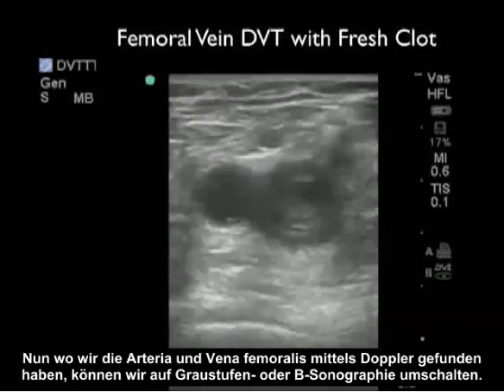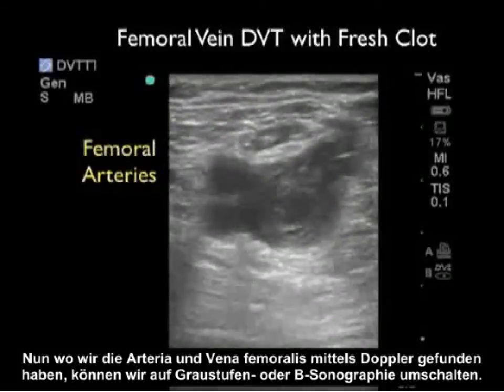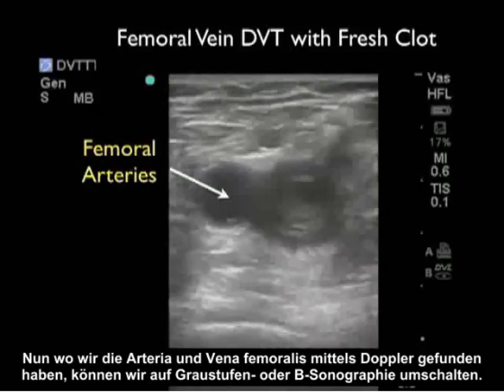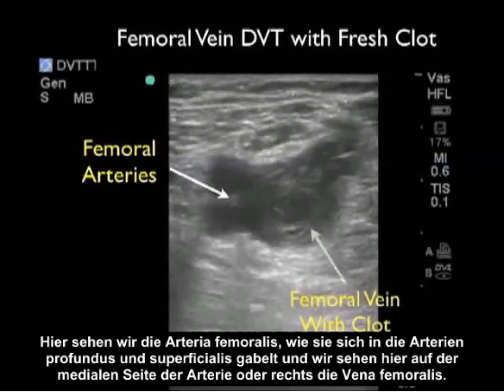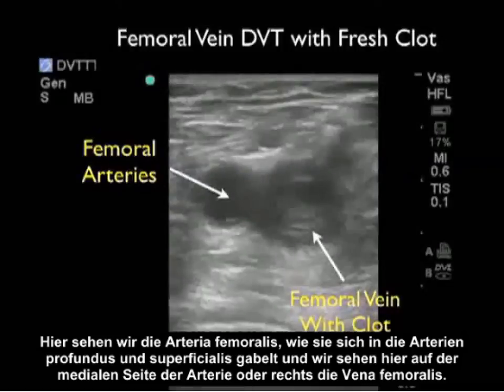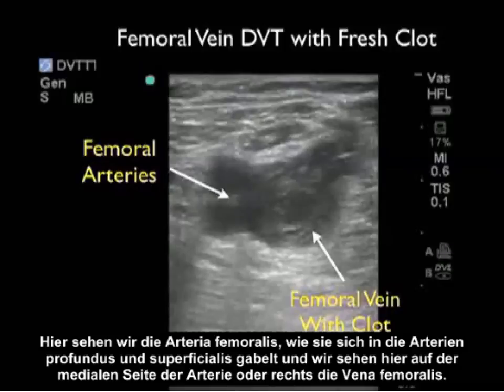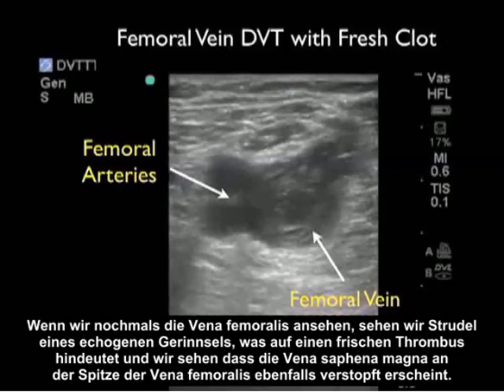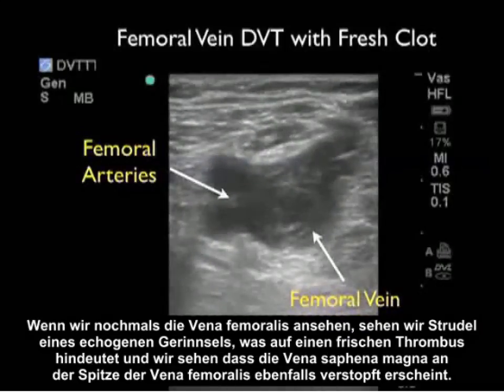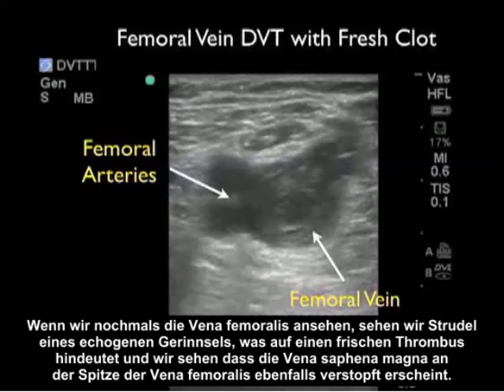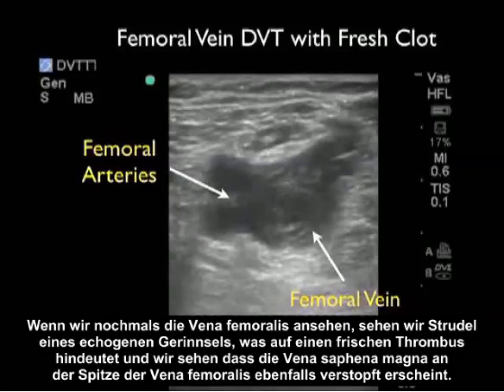Now that we've identified the target femoral artery and vein using Doppler flow, we can switch over to grayscale or B-mode sonography. Here we're looking at the femoral artery as it bifurcates into the profundus and superficialis arteries, and we note towards the medial aspect of the artery or towards the right, the femoral vein. Looking within the femoral vein, we see swirls of echogenic clot consistent with fresh thrombus, and we note again that the saphenous vein off the top of the femoral vein appears clotted as well.